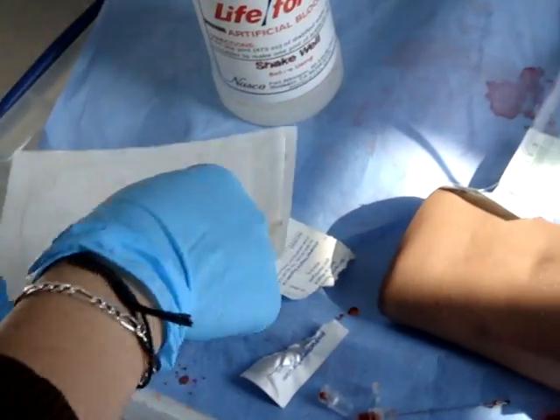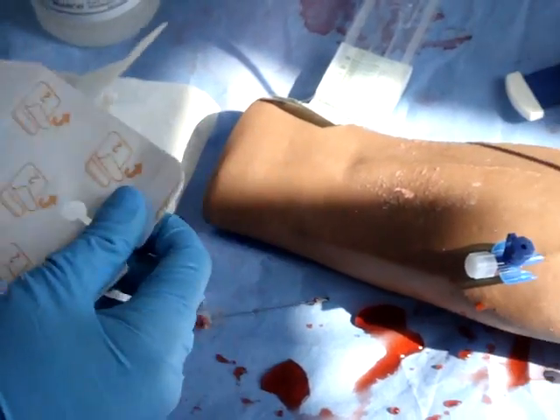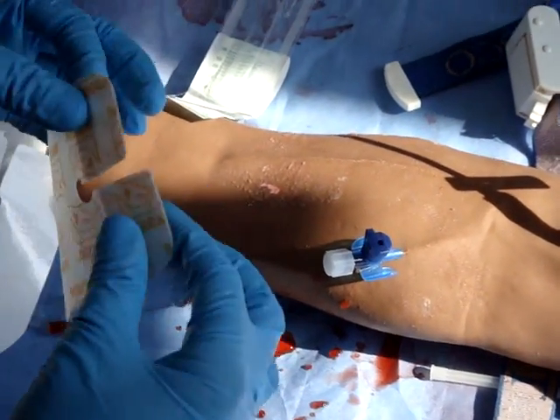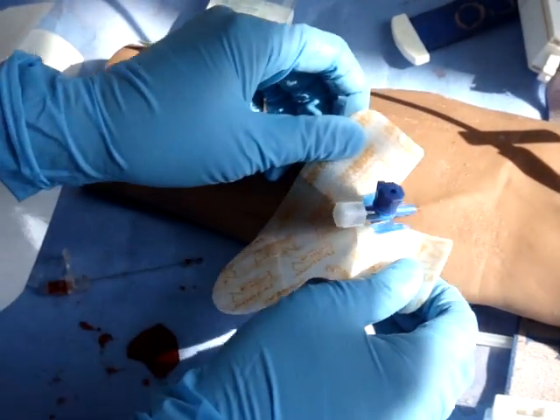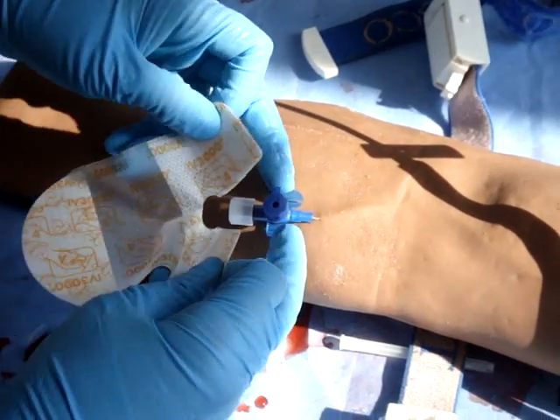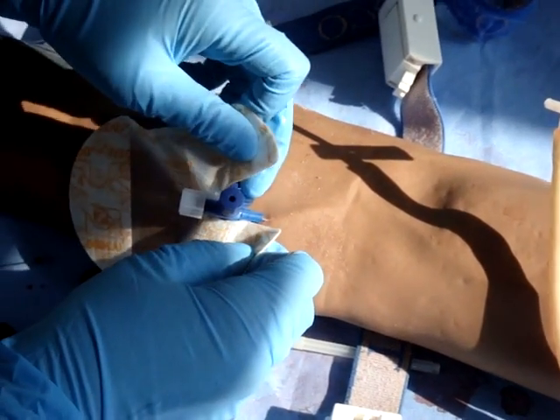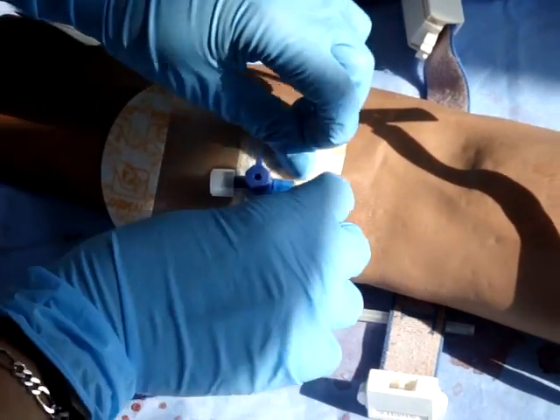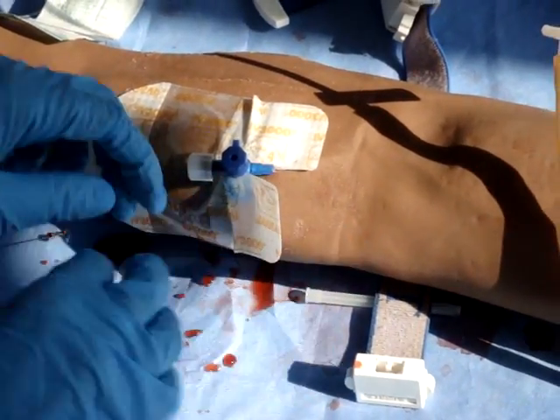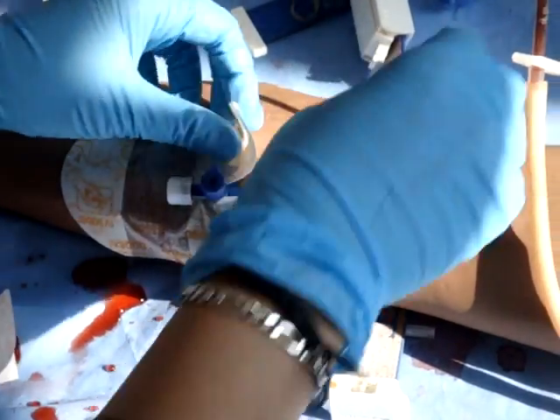Remove the tourniquet. Use the sticky pad dressing — open it and ensure the sides cover the wings of the cannula. Remember to place the cannula away from any joints, as movement may disrupt its use. Remove the backing and stick it down securely.